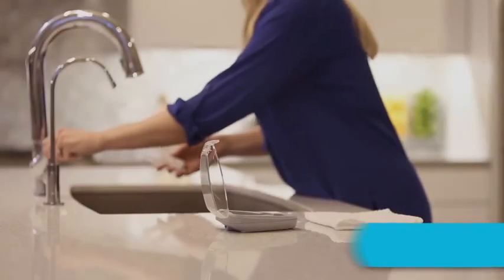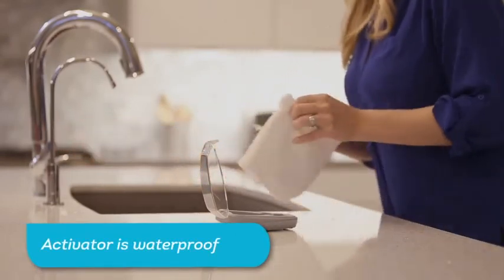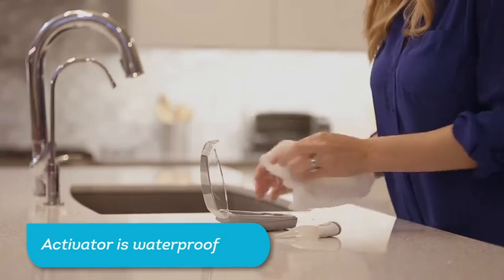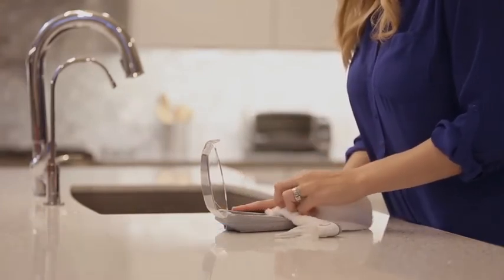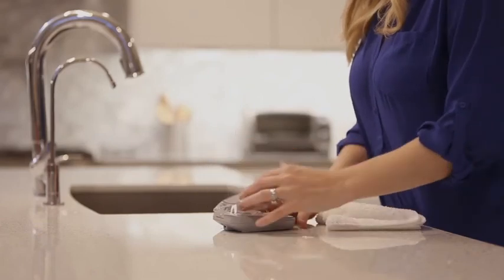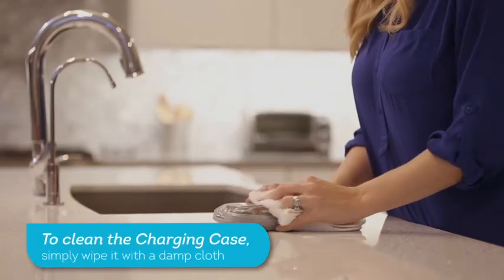To clean your Accelident Optima, simply rinse the mouthpiece after each use. The activator is waterproof, but it is recommended that it not be submerged in water or cleaning solutions for an extended period of time. Your charging case is not waterproof and should not be exposed to running water. To clean the charging case, simply wipe it with a damp cloth.